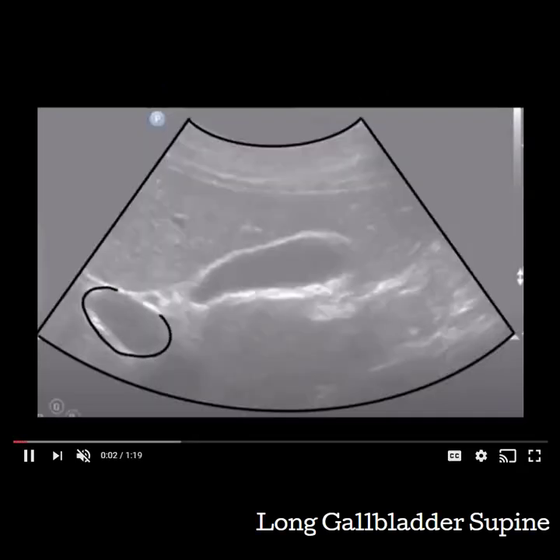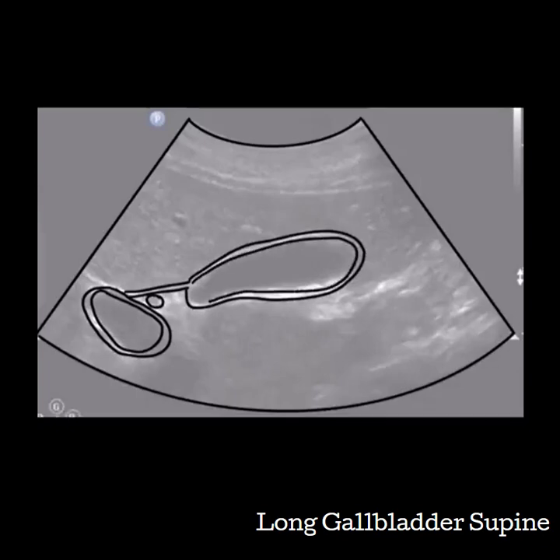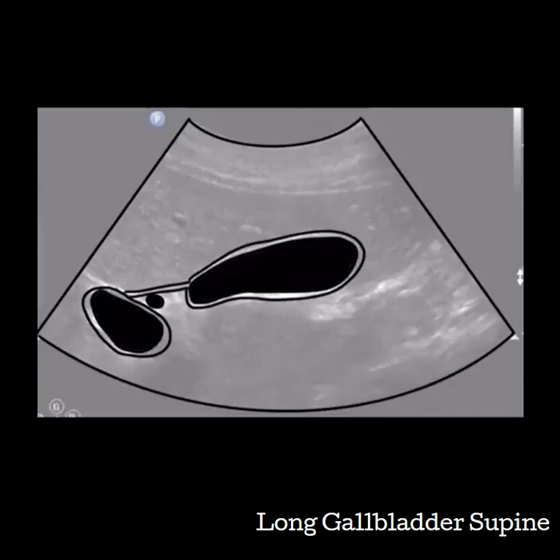The gallbladder will appear as a pear-shaped organ. Use your gain and TGCs to make sure that your gallbladder is cleared of artifact. Do not overly correct though. You should still be able to see the low-level gray of the surrounding liver.